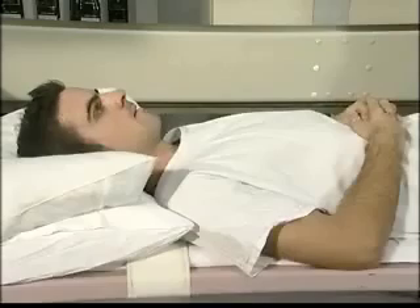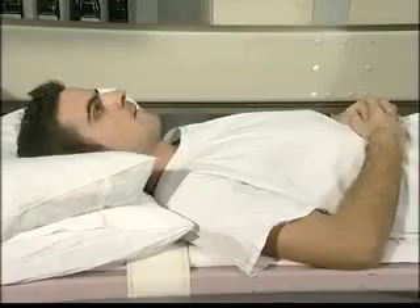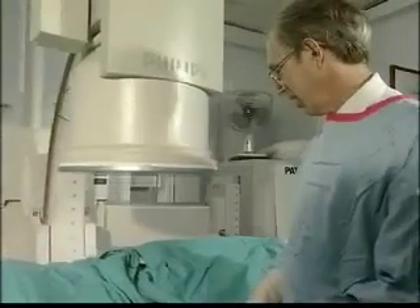The dye mentioned is a contrast medium containing iodine. As iodine has a high atomic number, it attenuates the x-rays far more than blood or soft tissue. So if it's injected into the bloodstream, the blood vessels will show up clearly on an x-ray image.